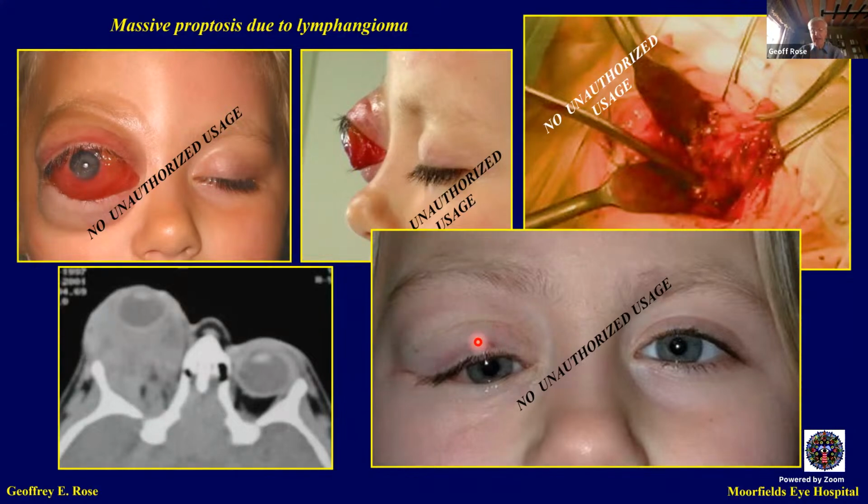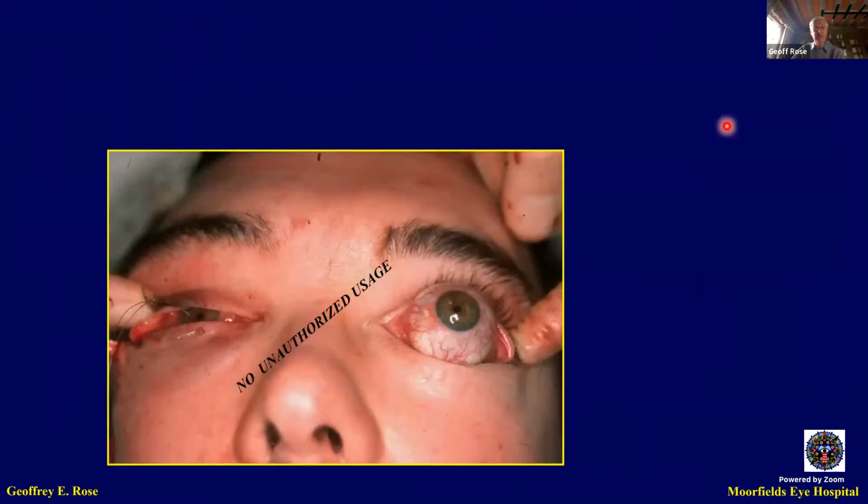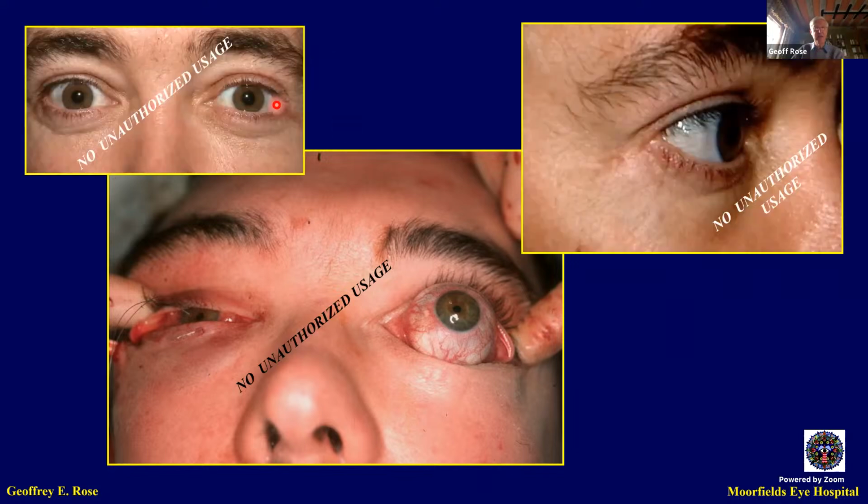And we're going to tidy up her lacrimal glands slightly more. So it's a very useful approach, the lower lid skin crease. I used it a lot in the past, in the early 90s, for minimal incision decompression. Up till then, people were tending to use the bicoronal flap, but I found that you could do it really through the outer angle and the lower lid swing. And as you can see, get an excellent result. And here he is after surgery with the healed incision, gone back about 11 millimeters on each side.